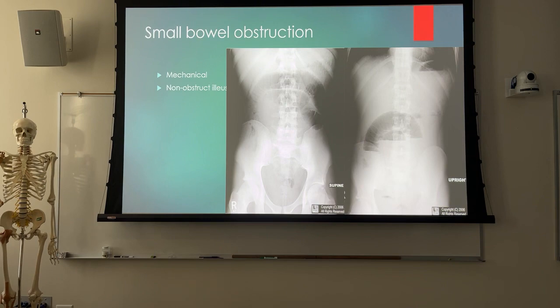So it could be a patient has had surgery, so medication can cause the bowels to stop, right? Pain can cause the bowels to stop. So, you know, if you've had kids, you know that, and if you've not had kids, here's your indication. You're going to have an ileus. Most likely when you go into labor, your bowels are just going to say, I don't want to do this. And you've got a non-obstructive ileus. It happens. If you don't know, they're going to give you an enema to try to get rid of some of that before you go into labor. Okay?